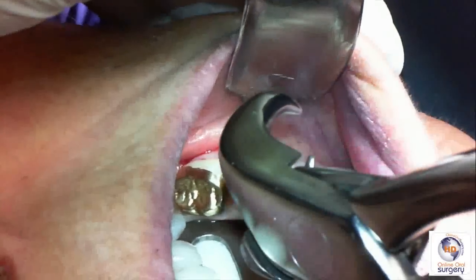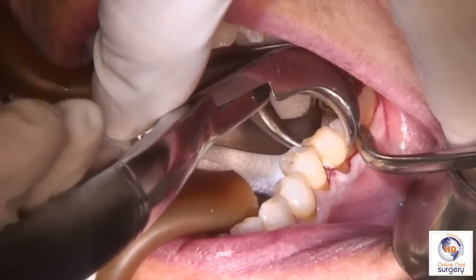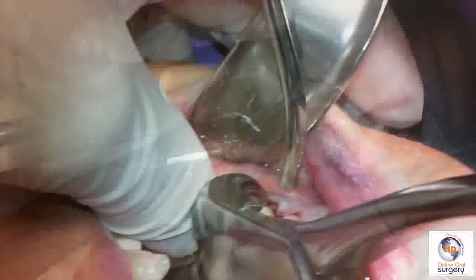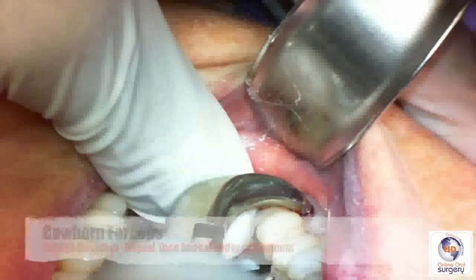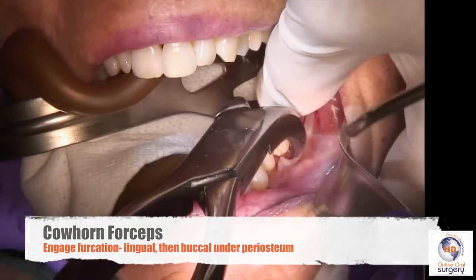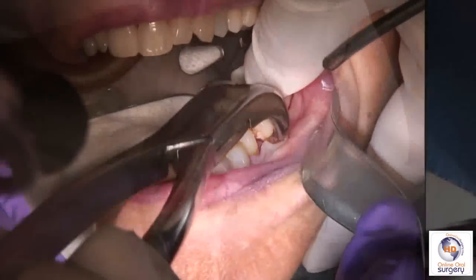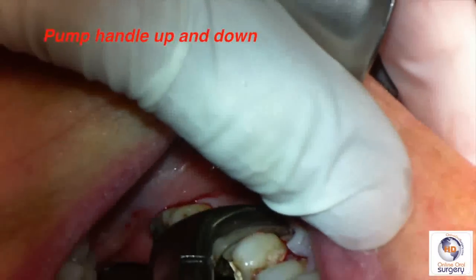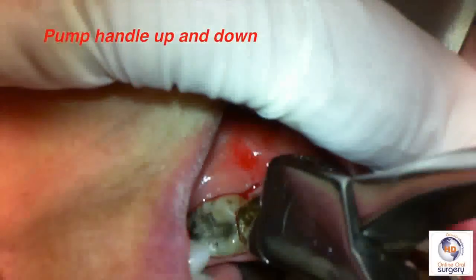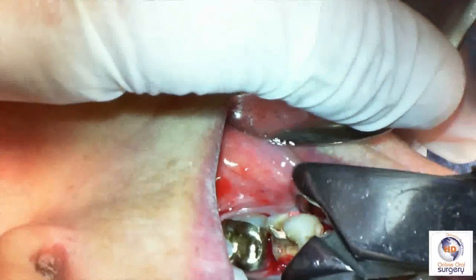Once we've got buccal and lingual mucoperiosteum reflected, we're going to come in with our cowhorn forcep. There is some fracture of the tooth structure on the distolingual, but we're going to be placing the beaks of the cowhorn into the furcation — on the lingual side first, and then into the furcation area subperiosteally on the buccal surface. We're going to pump the forcep up and down, which drives the beaks deeper into the furcation. As it does, it acts as a class-one lever which will, hopefully, lift the tooth out of the socket.